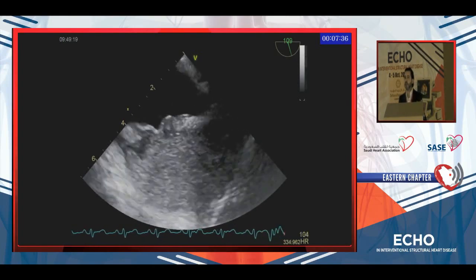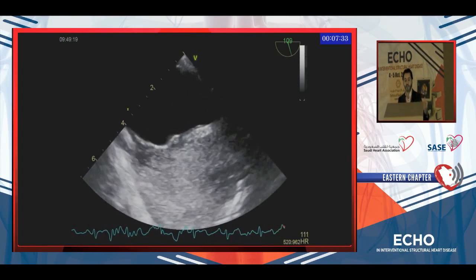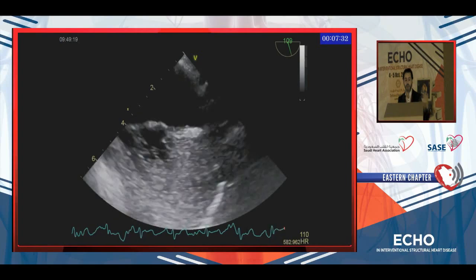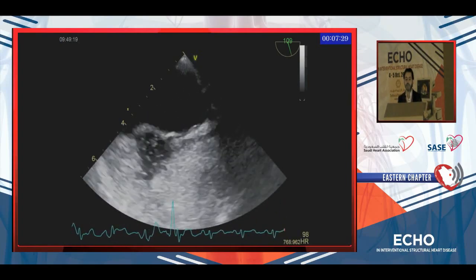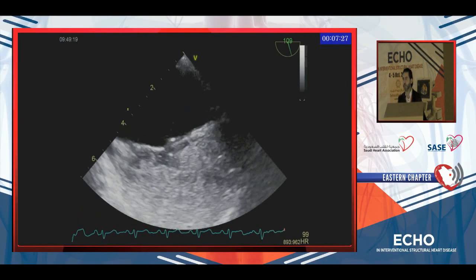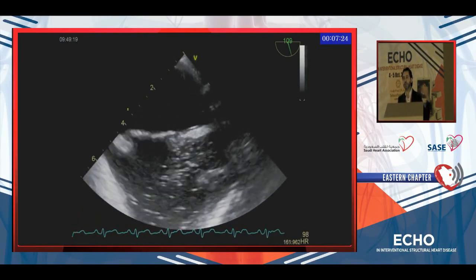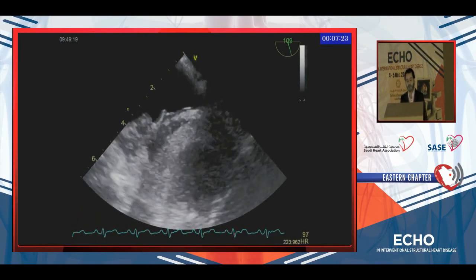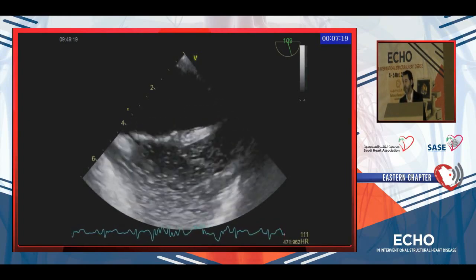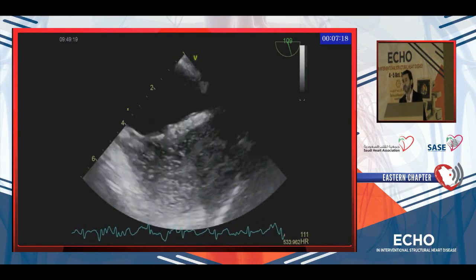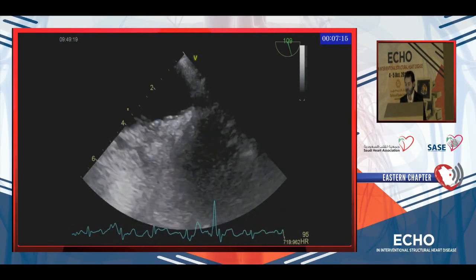Sometimes you have to really try to perform good maneuvers to see the septal shift to the left side. Look carefully — once we raise the arm and leg and do abdominal compression, you will see the leftward shift of the septum caused by increased RA pressure. If you cannot perform this, your report might be inaccurate.